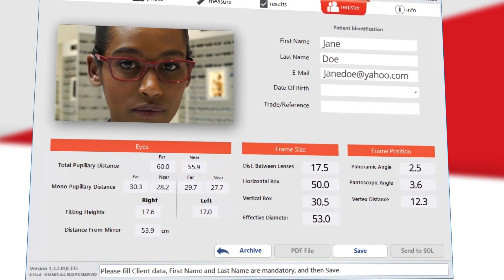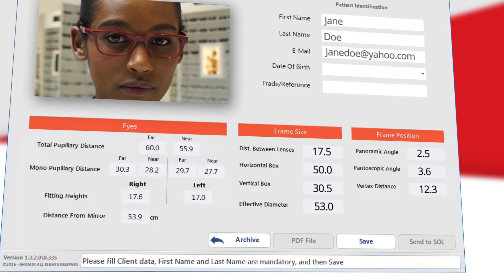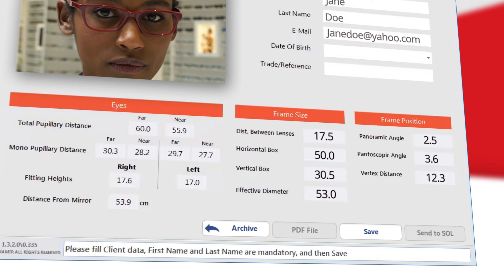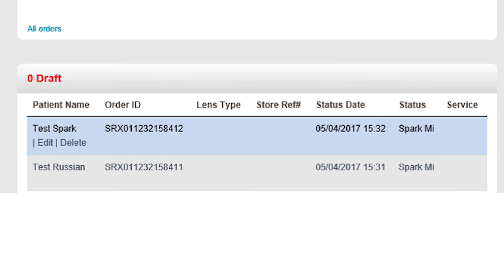Results can be emailed by selecting Send as PDF at the bottom of the results screen; however, internet connection and an active email account on your PC is required. With a Shamir Online account, you can send a job order directly to Shamir via Shamir Online — just click the Send to SOL button. Once the job order is successfully sent, it will appear in Shamir Online in draft status. Choose Edit to proceed with the ordering process.